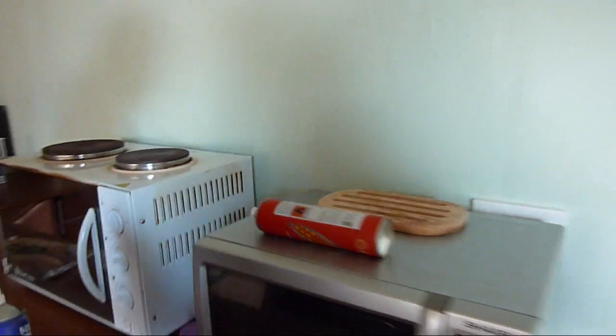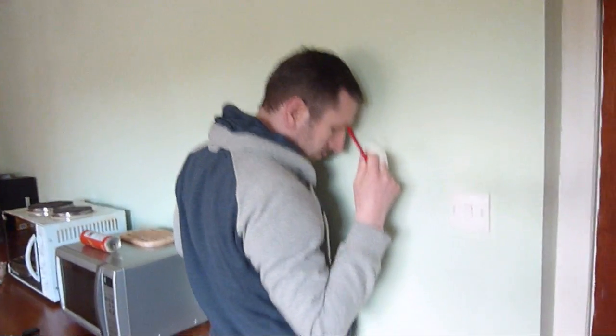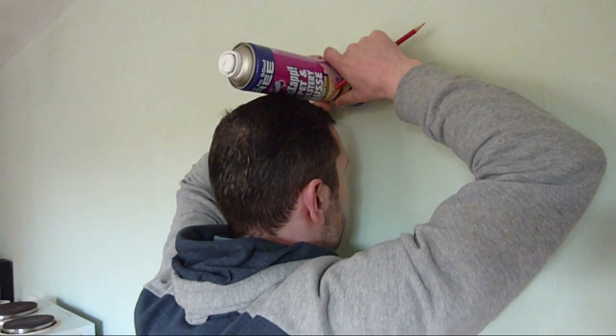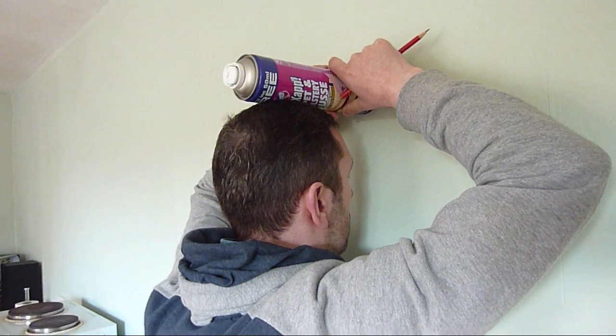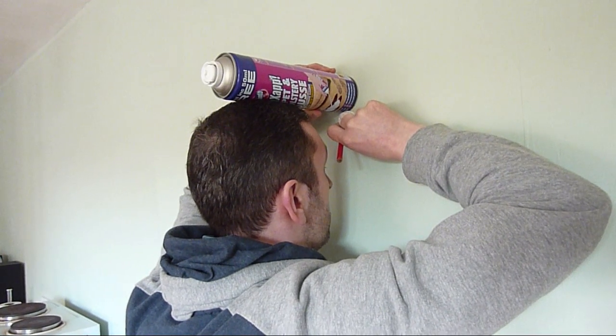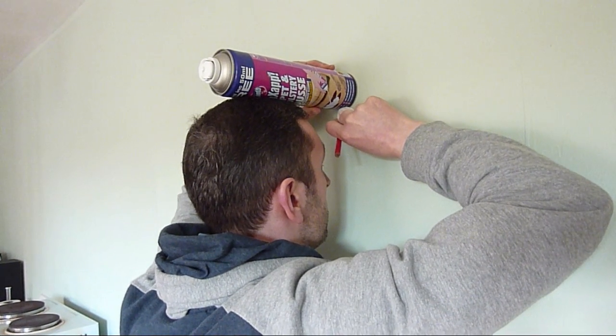I'm going to use a big one. And I'll stand the same way for both measurements. Feet just right beside the wall, standing at my tallest, and looking straight ahead. Make sure that's touching the top of my head. And then I'll put a little pencil mark right against the can. And if we bring it in, we'll see the little pencil mark.